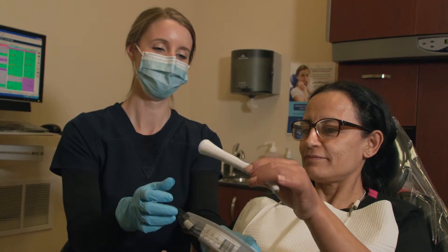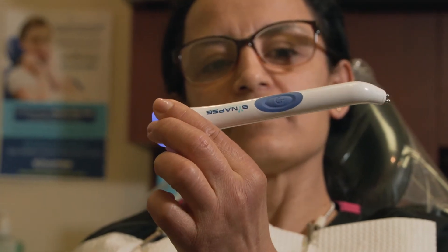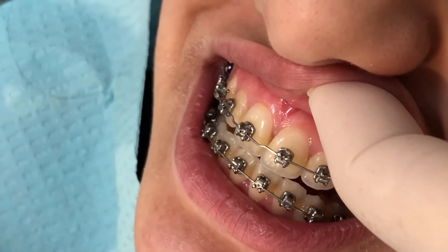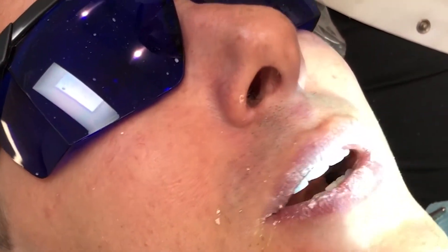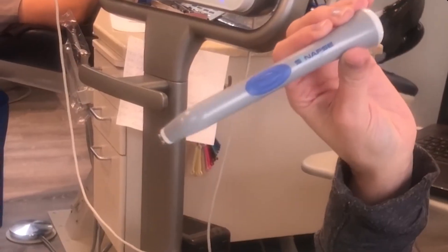Patients are amazed at how it works and are very curious to know what it is. 'Is that like witchcraft or something?' I think it would take everyone's fear factor away because it's pain-free. It's crazy — I didn't think you could put it on the tooth surface. It's amazing. I think this is going to be a game-changer.